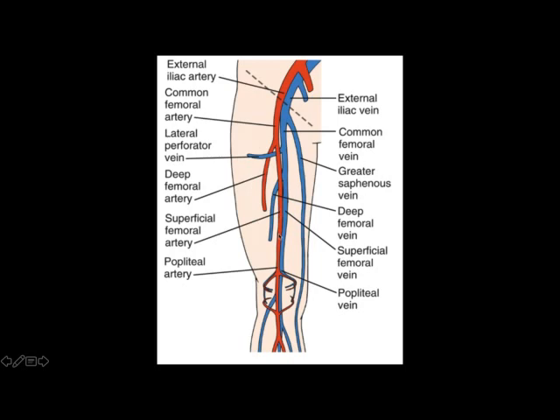The superficial femoral artery then continues along beside the superficial femoral vein until the level of the popliteal fossa, where it gives rise to the popliteal artery. You can see this artery at our final fifth point of interrogation, where it lies deep to the popliteal vein.